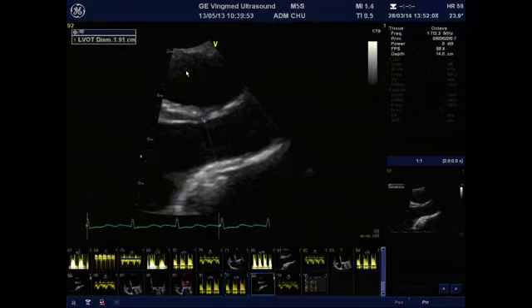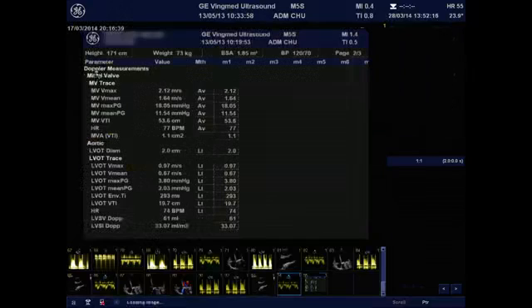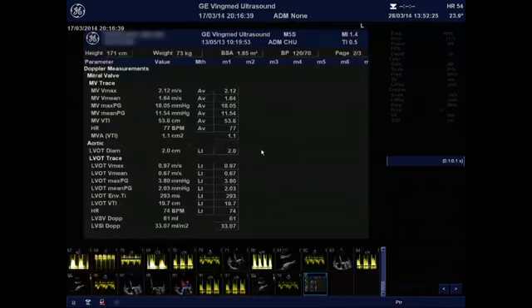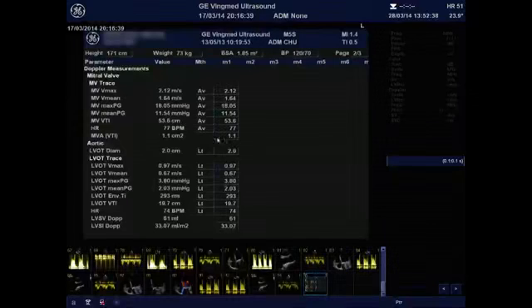And if you use the continuity equation with the left ventricular outflow tract diameter and the left ventricular outflow tract velocity time integral, you can calculate the mitral valve area of 1.1, and the reference value for that kind of prosthesis is 1.3. So it's in the normal range for that kind of prosthesis. So now what you need to assess is the indexed mitral valve area. To do this, you need to divide the mitral valve area that you obtain with the continuity equation by the body surface area of the patient.